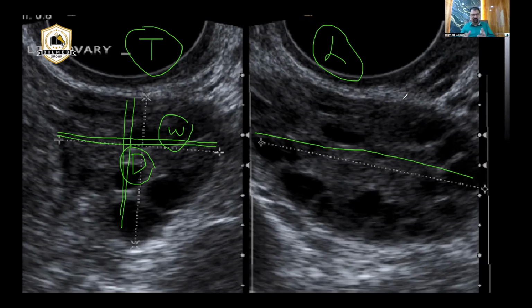When you are taking the printouts, you are assuming that this is just to save paper. No, in fact, it has the function to take the volume, in this case of the ovary. Now, when you have taken one measurement in one section in transverse and one section in longitudinal, keep it on the screen and give 3 measurements. And in the longitudinal section, when you are measuring from here to here, you are actually taking the length.